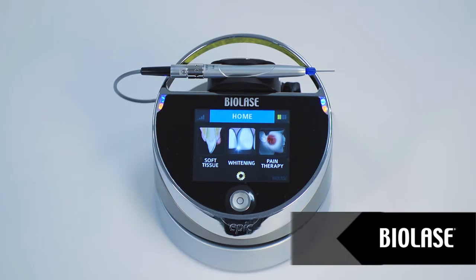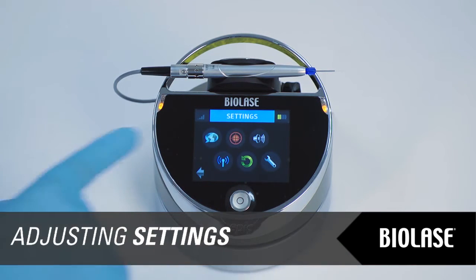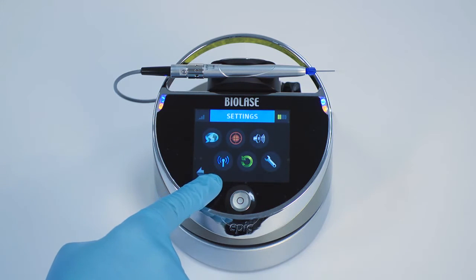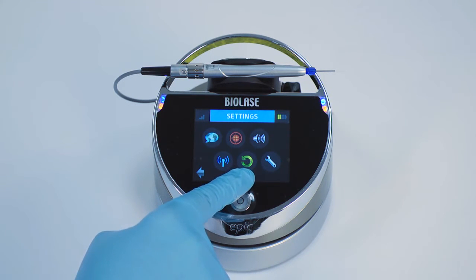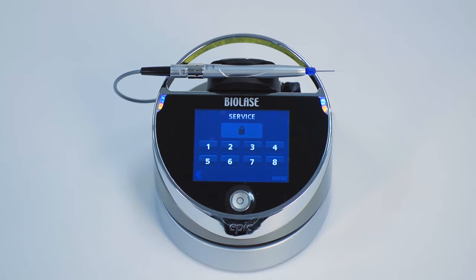If you wish to adjust system settings, tap the settings icon on the home screen. On the settings screen, you can change settings for language, aiming beam brightness, system volume, or restore factory settings. The service mode button is accessible only by an authorized Biolase service representative.